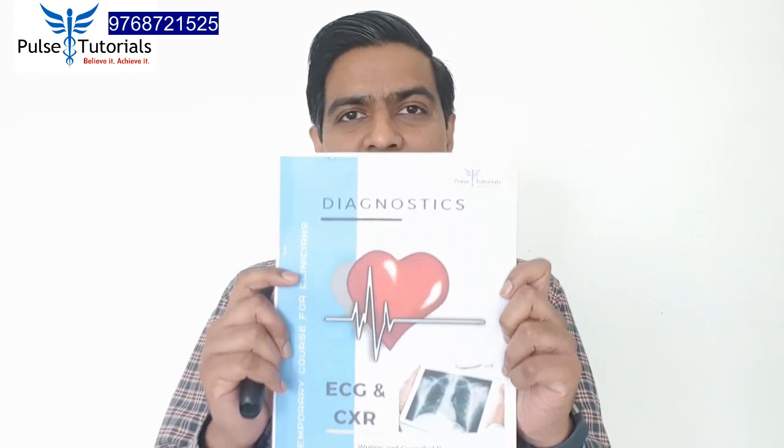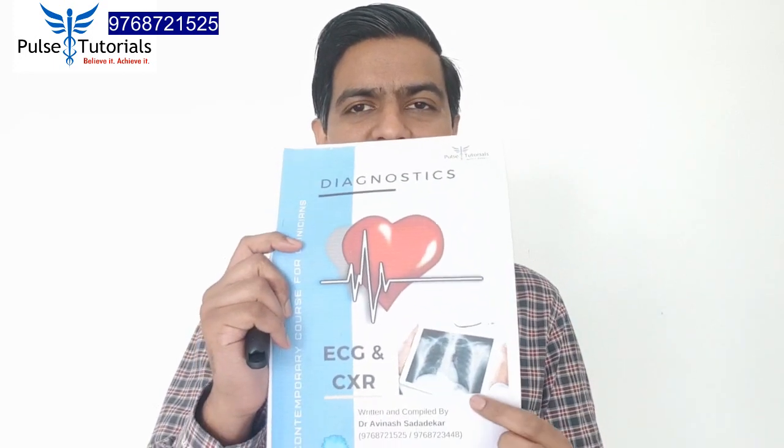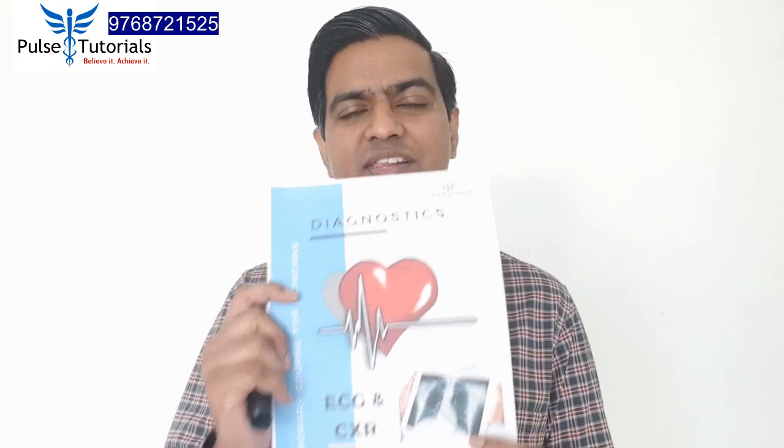For this, we definitely need the worksheet, because in this worksheet we have a section for chest x-ray. So let's start with our topic for today. We are having a look at a step-by-step guide to chest x-ray.